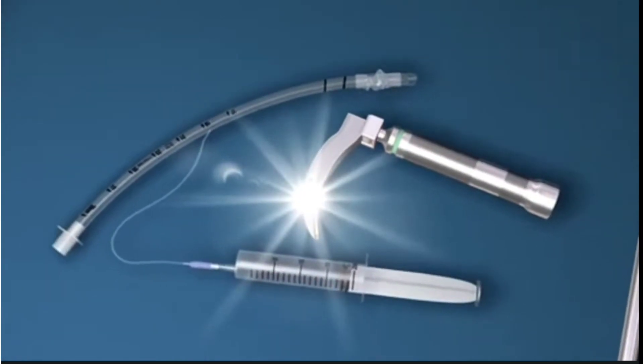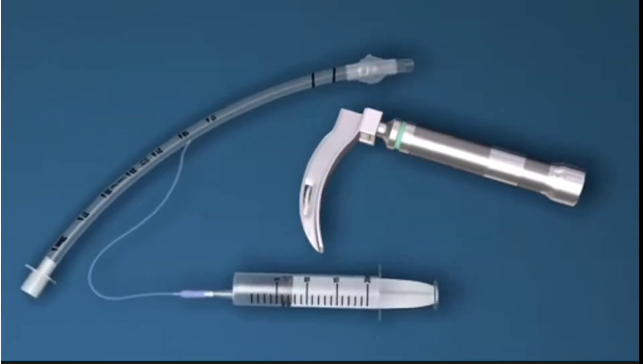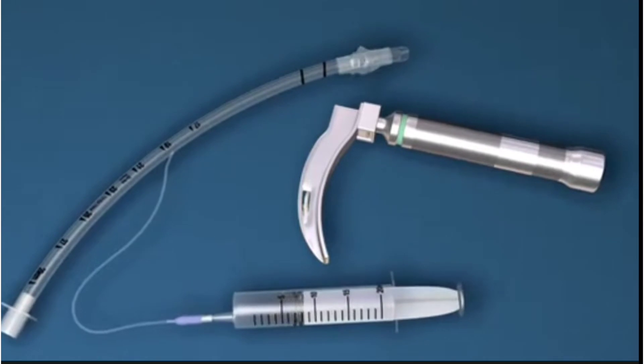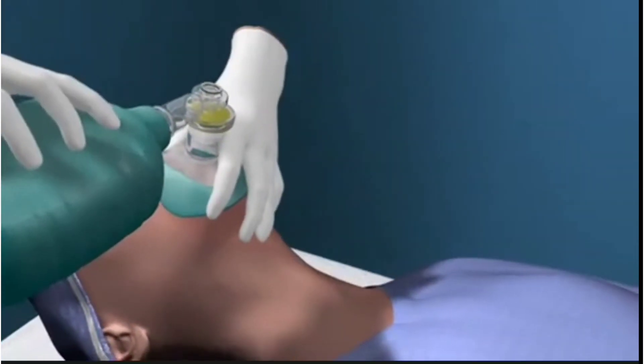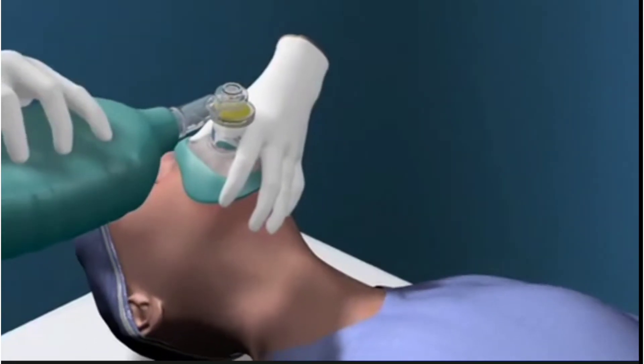Check that the laryngoscope is working and the cuff on the tube inflates and deflates properly. Pre-oxygenate the patient with bag and mask ventilation for up to one minute before attempting to intubate.